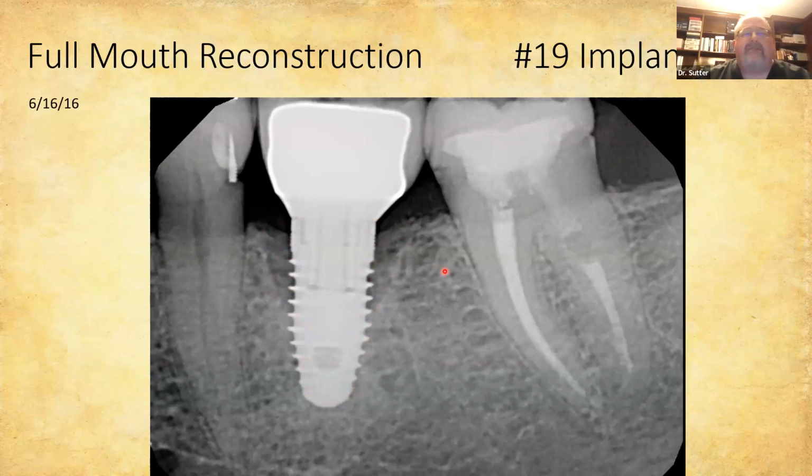And then dentists were leaving inordinate amounts of cement. Well, it doesn't look like there's any cement here, so we can check that off our list. And the one thing that we're not doing, and still just so puzzled when this happens, is the patient has zero proprioception on implants because there is no nerve and they're being overloaded. So that's what we suspect is going on.